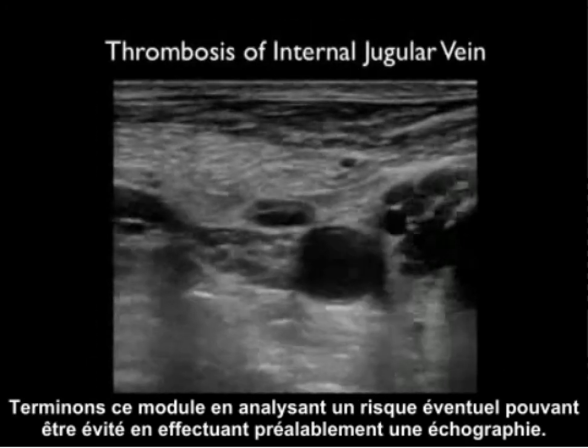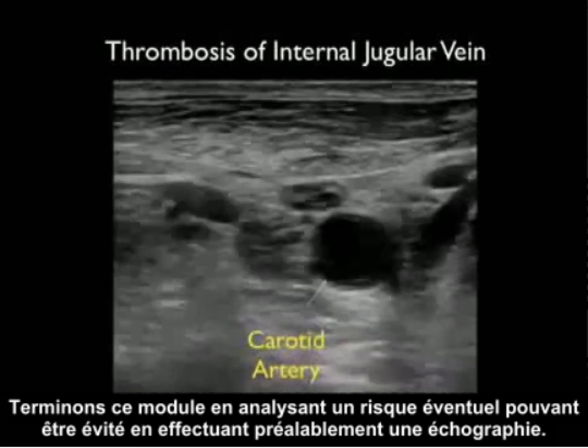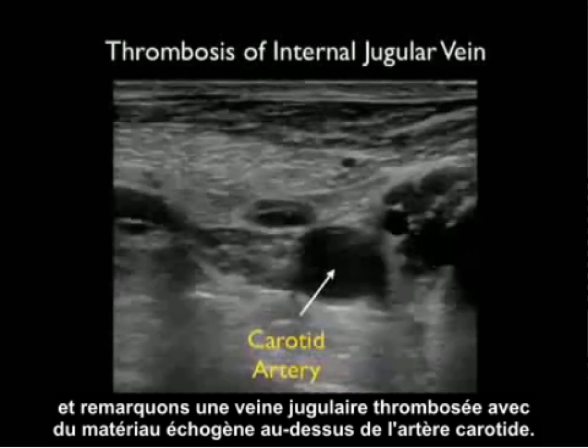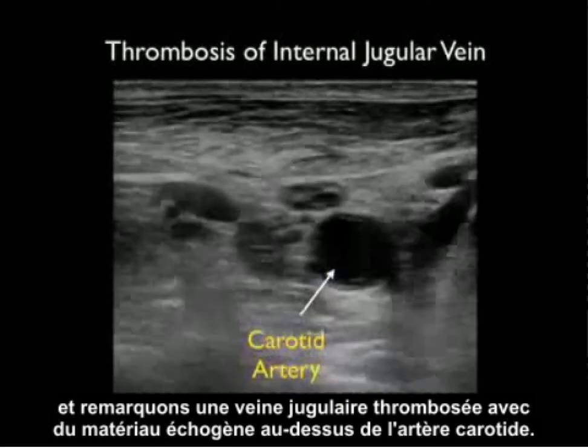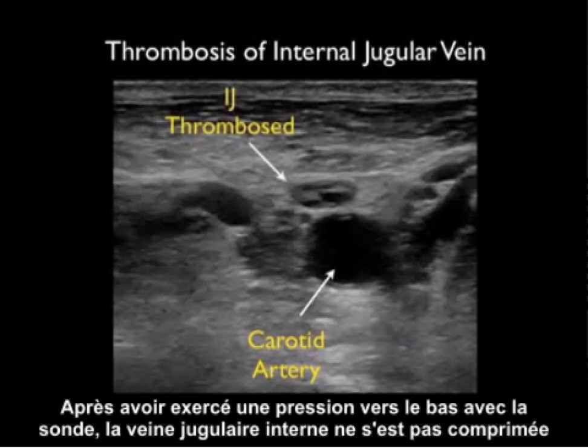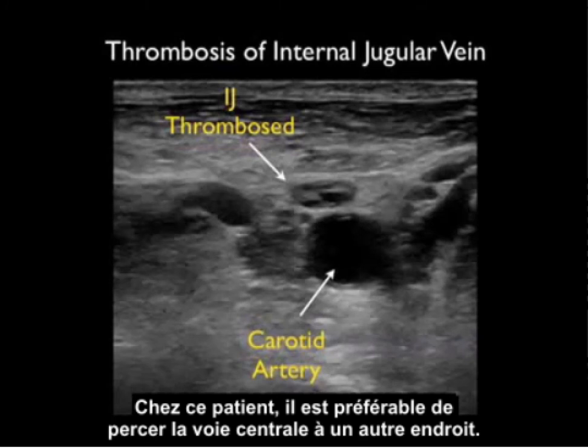Let's end this module with a possible pitfall that can be avoided by first looking with ultrasound. Here we have a patient who's had a prior central line and we notice a thrombosed internal jugular vein with echogenic material on top of the carotid artery. When we push down with the probe, the internal jugular vein failed to compress. In this patient it would be best to look for an alternative area for puncture of a central line.